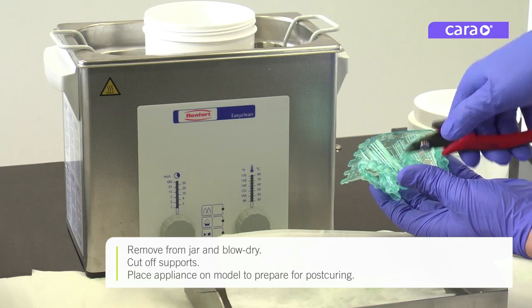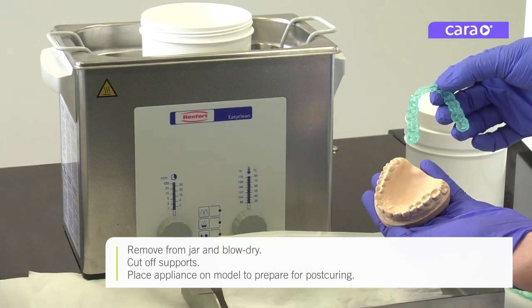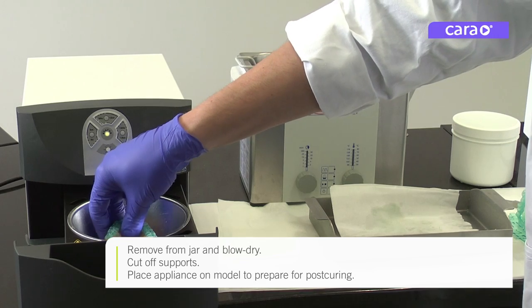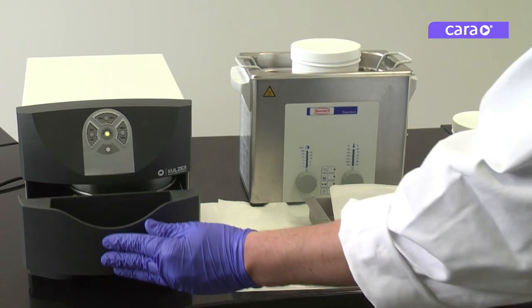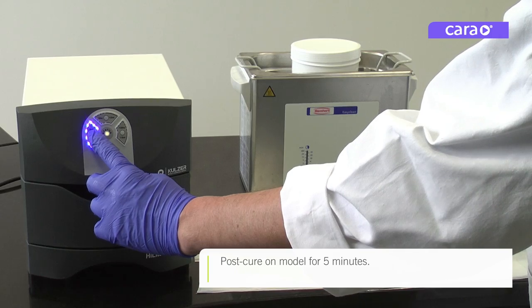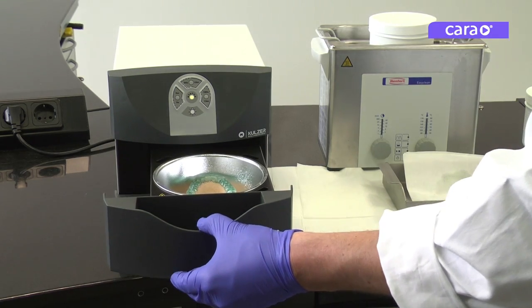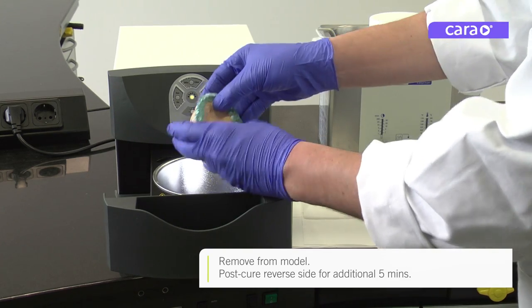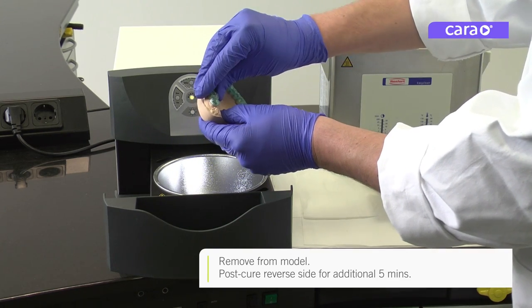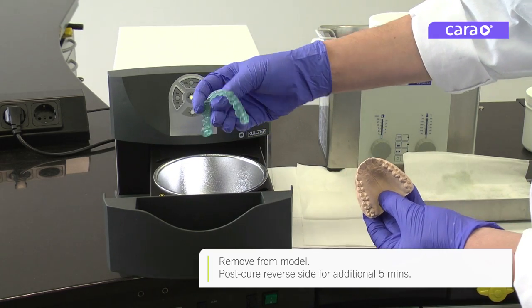Cut off the supports. Place the splint or other dental appliance on a model to prepare for post-curing. Post-cure the splint on its model for five minutes. Remove the splint from its model, then post-cure the reverse side for an additional five minutes.